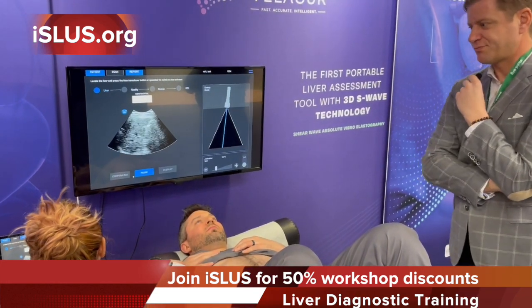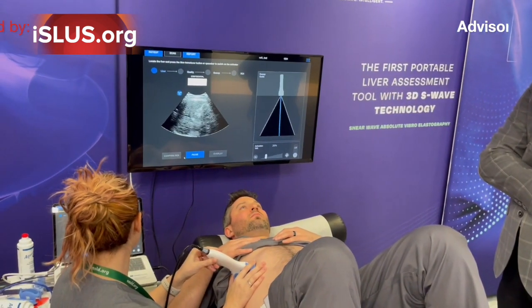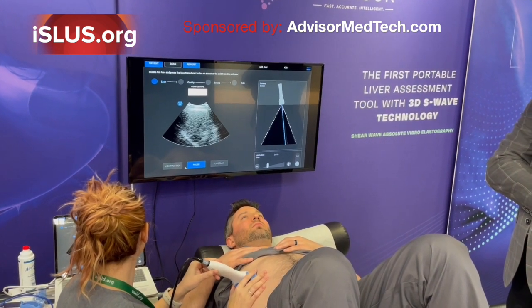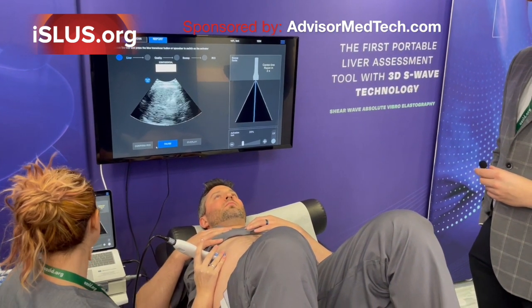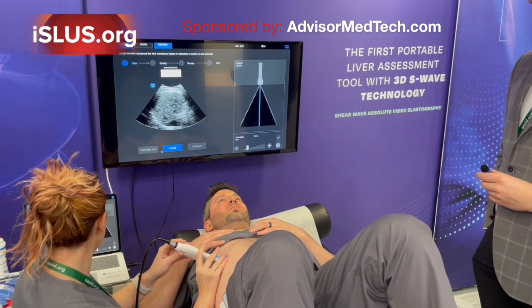So right now I'm just looking around, making sure that I've got lots of liver, and I will practice with my patient and their breathing. So can you take in a half breath for me and hold? Perfect. You can breathe. So looking at my image, I can see that I have liver here, diaphragm, back of the liver. Take a nice big deep breath for me. And there goes lung. Go ahead, breathe and relax.